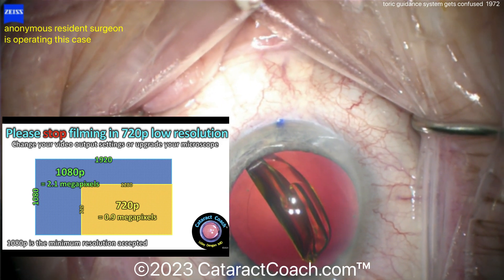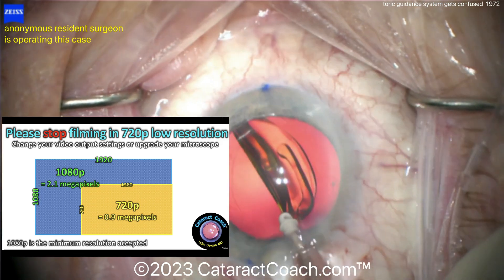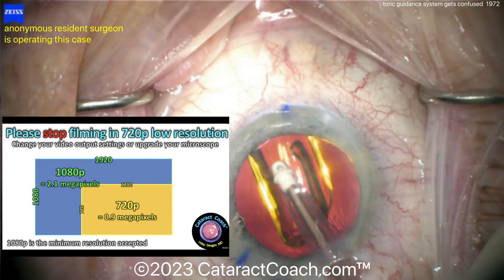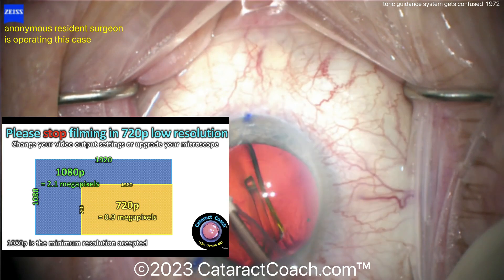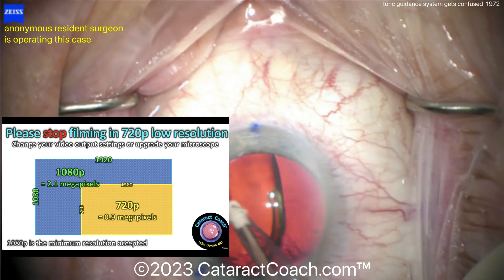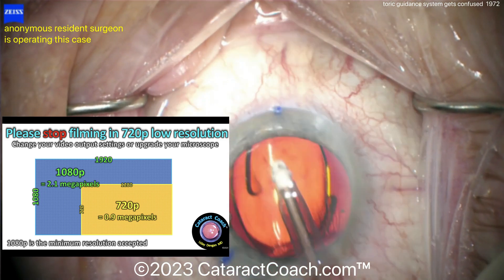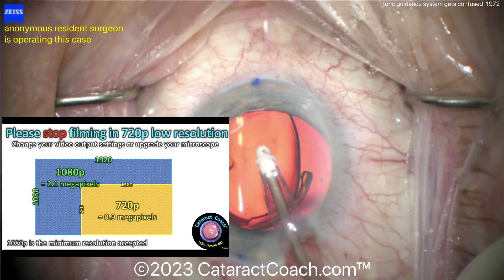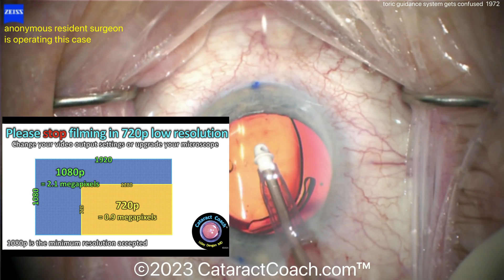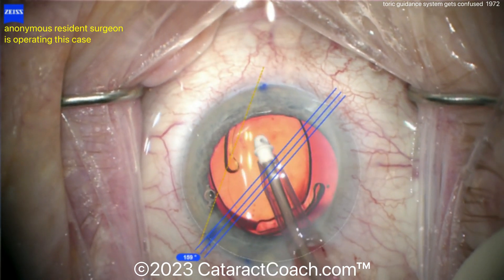The bare minimum you would watch on your television at home is 1080p, which is 2.1 megapixels, and you'd prefer to see even higher depth. Your mobile phone has a 4K camera, which is even much more resolution than this. So if you have a microscope that only puts out 720p video, you've got to fix that — change the settings, upgrade it, or make some other arrangements.